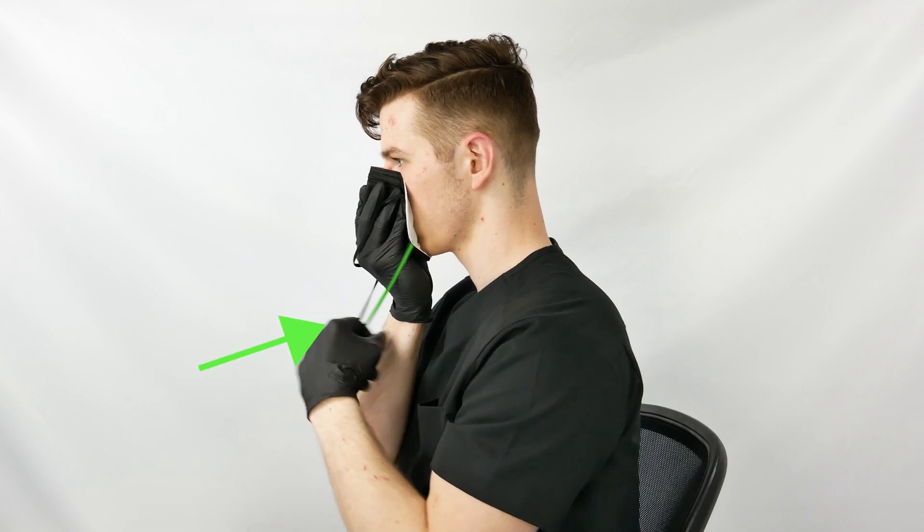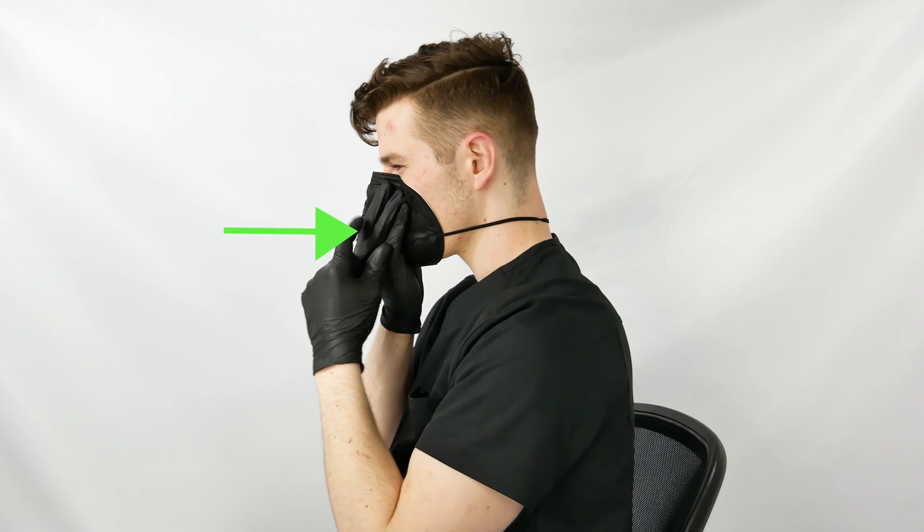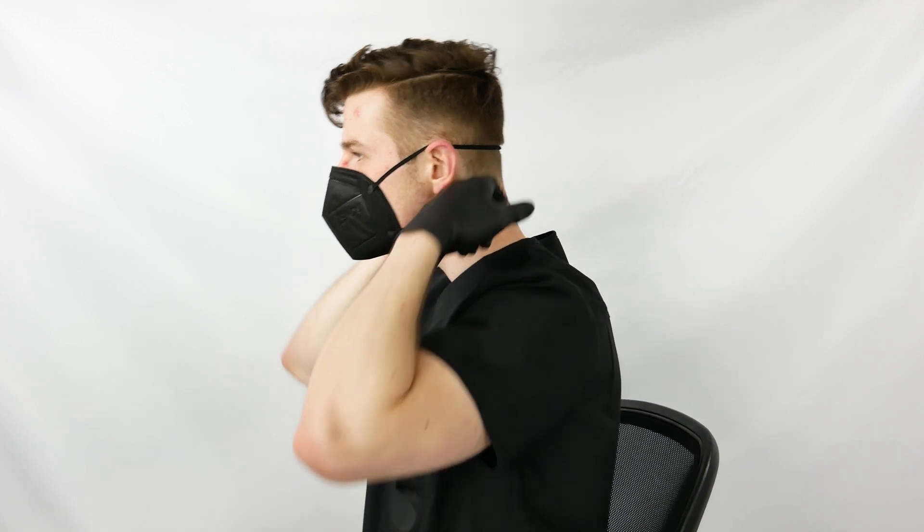Pull the lower band over your head and release it on your neck. Pull the upper band over your head and release it on the crown of your head. Straighten the bands and adjust the mask to a comfortable fit.